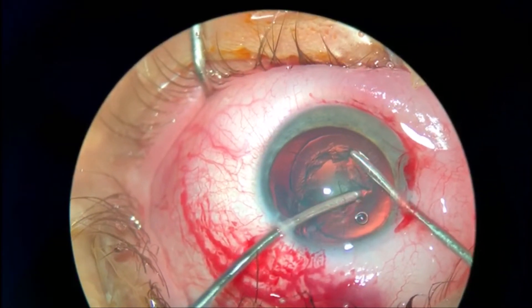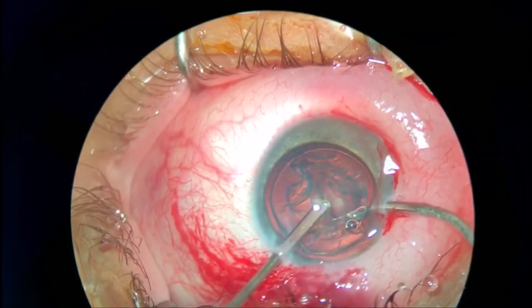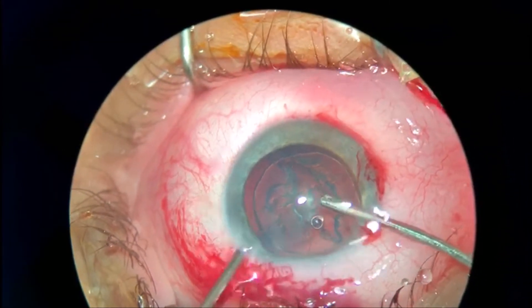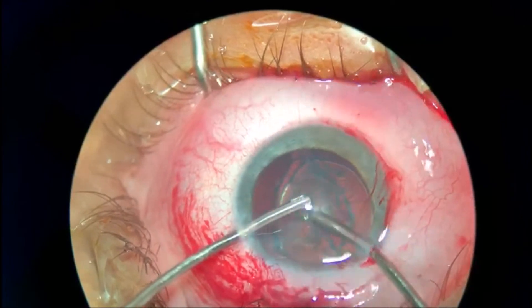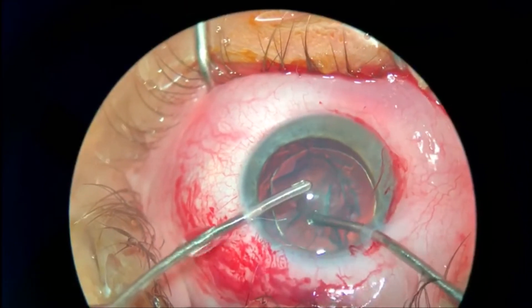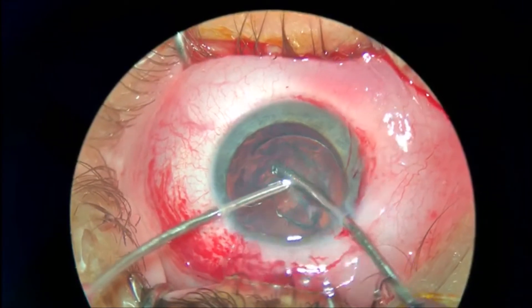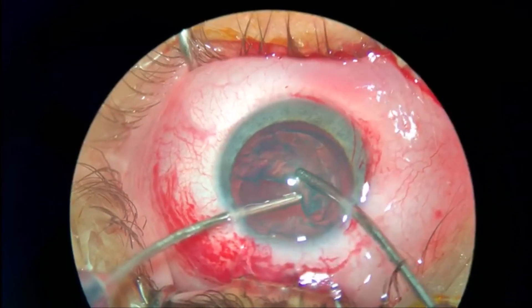Using the irrigation-aspiration ports — notice that right here you can do a trench just by using the irrigation or aspiration port, that is how soft the nucleus is. These cataracts are very easy to remove, but you need to have patience with the sticky nucleus and epinucleus, since it is very easy to catch the anterior capsule or the posterior capsule on the aspiration port.